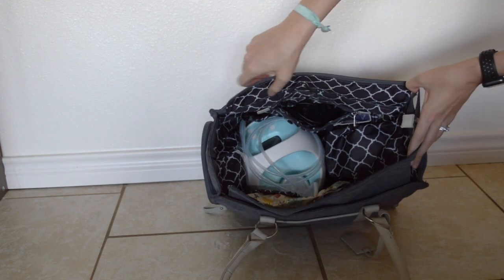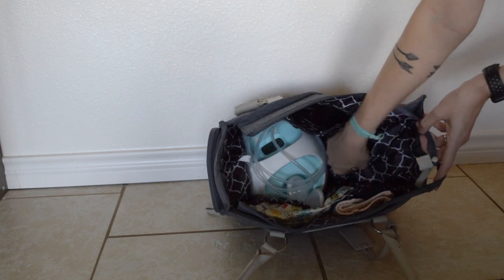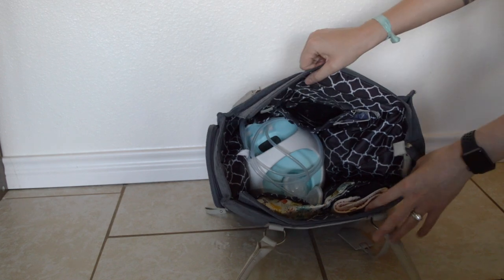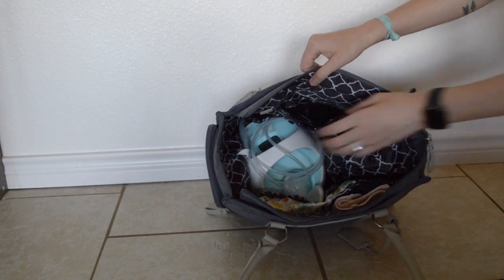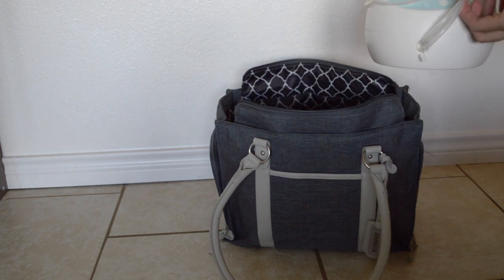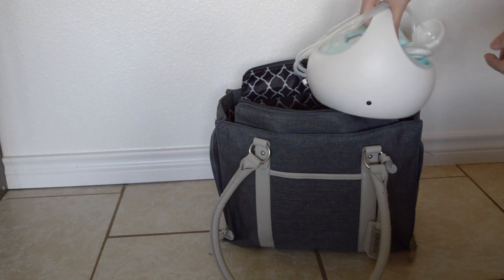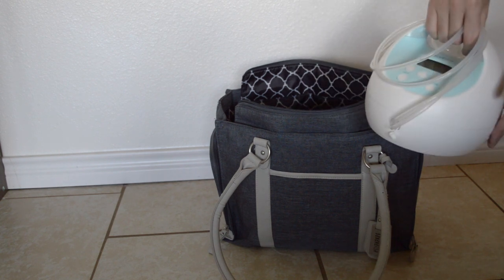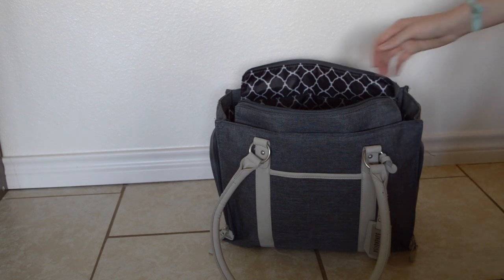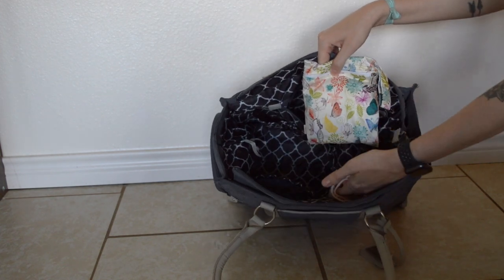This is the main compartment. You can see the pocket where my pump supplies are. I keep my pump right on the other side, and I'm able to keep the tubing connected at all times so I don't have to put it on and off — it does fit down in there. The bag also has two large elastic pockets down the side.